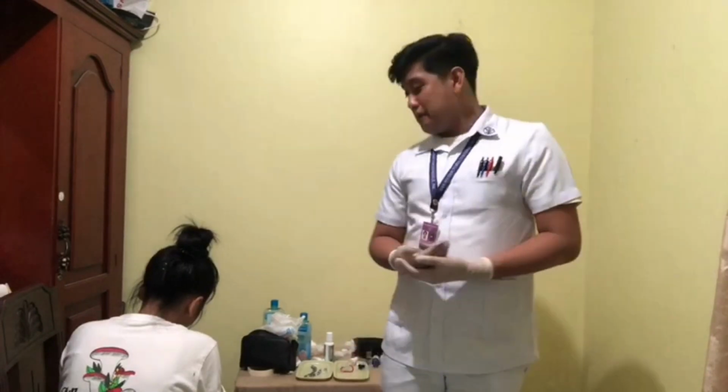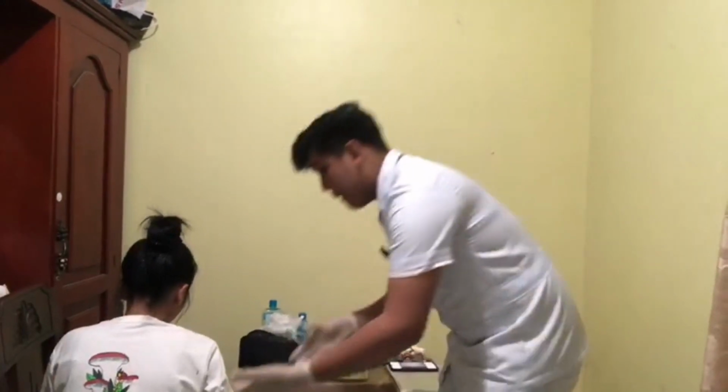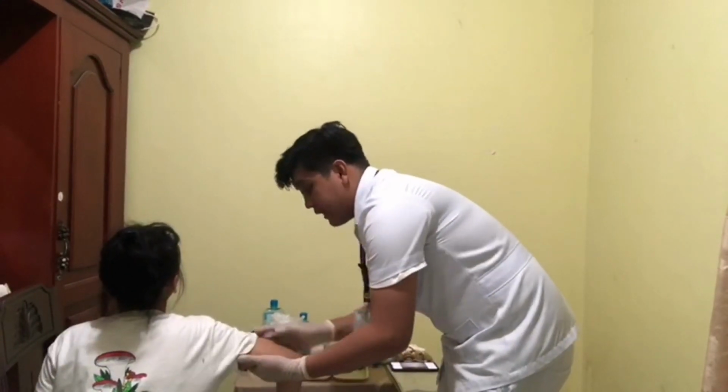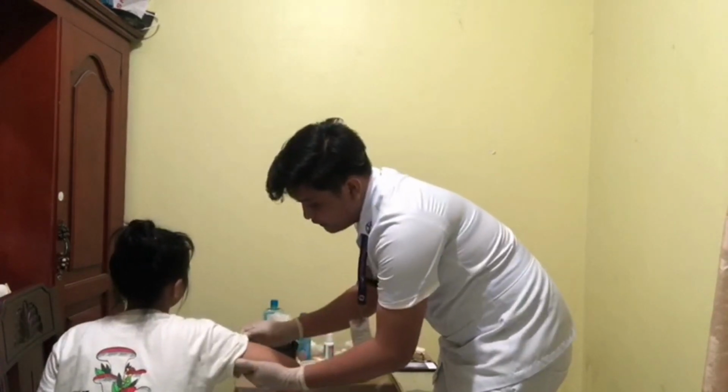This is to have easy access to the injection site. Okay, ma'am, are you comfortable with your position? Okay, thank you. So now, the site we will be administering is the deltoid muscle. So we have to check this site if it is free from lesions, scars, or swelling. Okay, ma'am, I am going to inspect if you have any lesions or swelling.